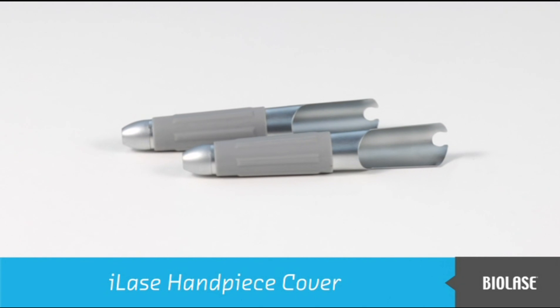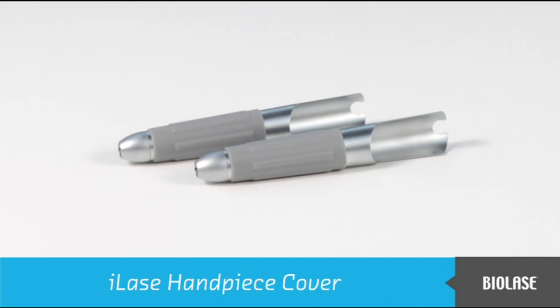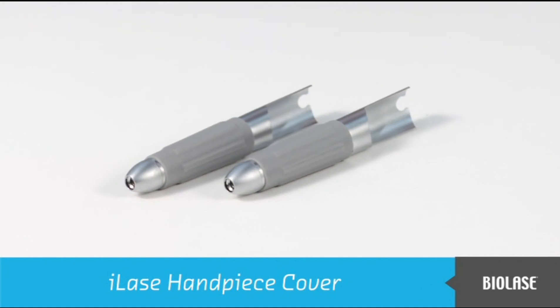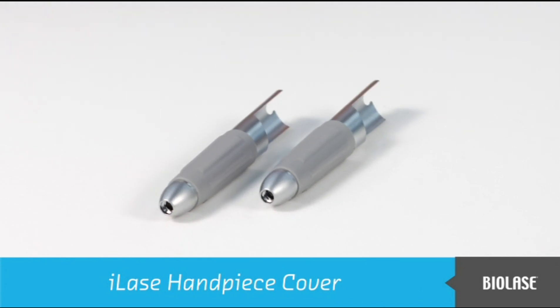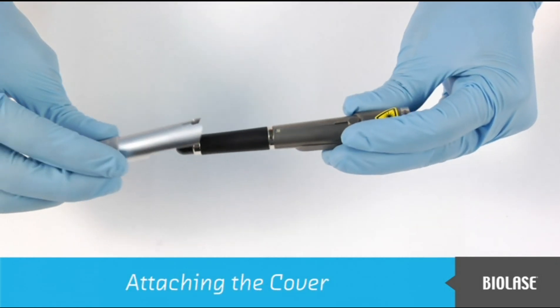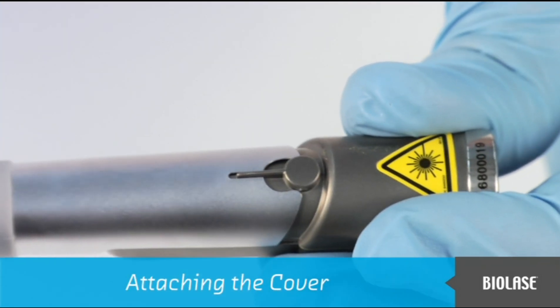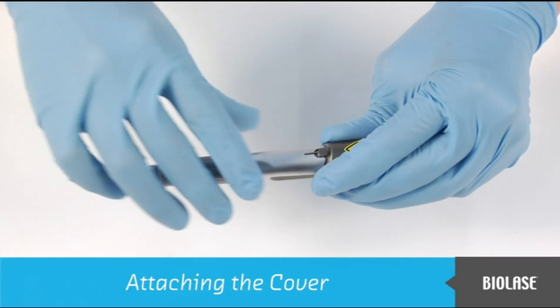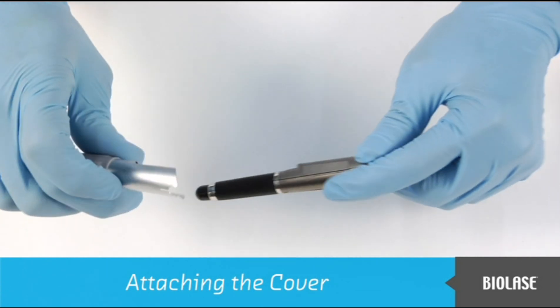The handpiece cover protects the main body, provides a grip for the finger switch, and accepts tips for delivery of laser energy. Before attaching the cover, make sure that it has been cleaned and sterilized. Slide the cover on the main body until it snaps completely onto the small bump. To remove the cover, simply pull it off from the handpiece.